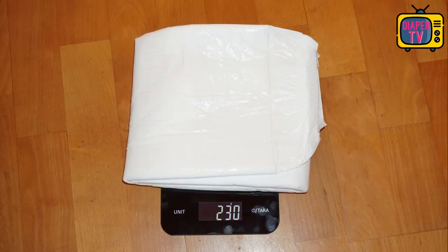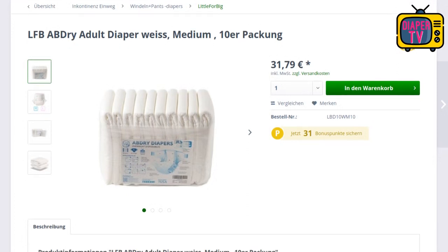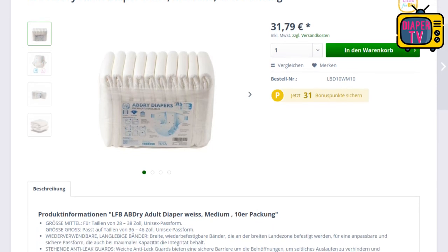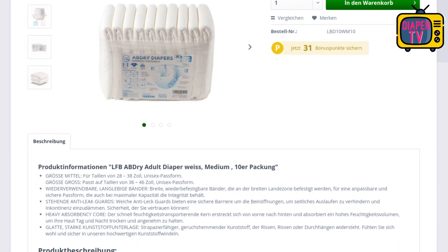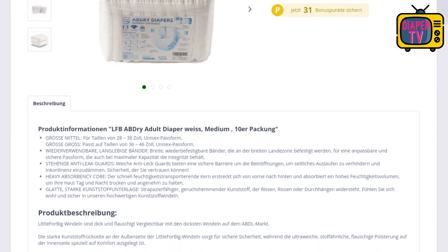An empty diaper weighs 230 grams, making clear it is a thicker diaper with comparatively much material. The diaper is available, but unfortunately currently only at a store that delivers to Germany — at least I'm not aware of others where you can order without importing. One package costs 31.79 euros and contains 10 diapers, making a price of about 3.18 euros each, which puts us at the beginning of the upper price range.